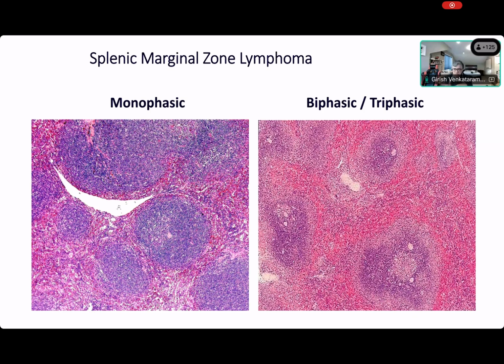And of course, you could ask me, how do you look at the picture on the right and tell me that this is lymphoma, right? If I just show you that in isolation, you would say that that's probably just marginal zone hyperplasia occurring in the spleen. How do you get to lymphoma, right? But your clue will be the weight of that spleen. Now I'll tell you that the weight of that spleen on the right side was 1 kilogram, right? So obviously you have to connect the dots. No normal person can have a 1 kilogram spleen.